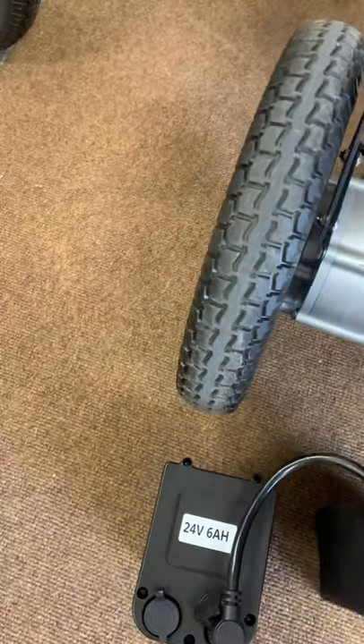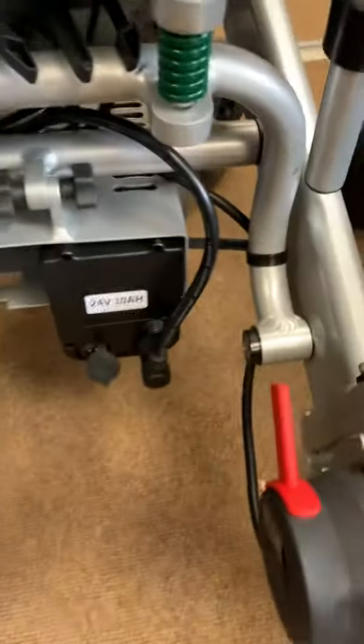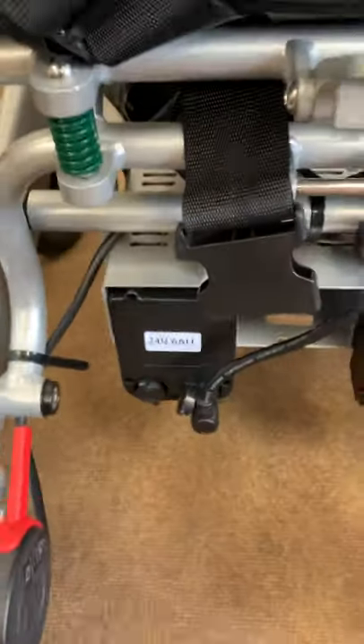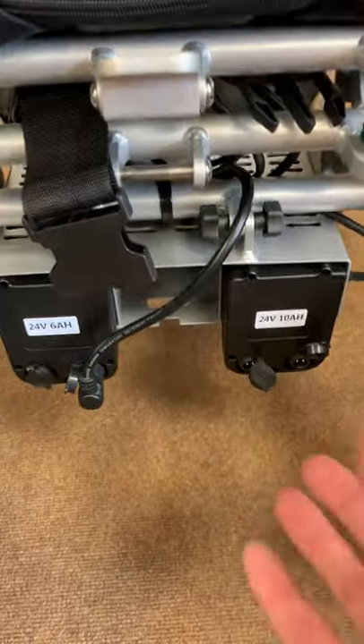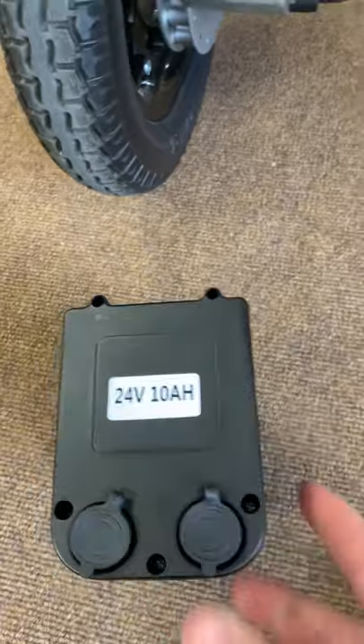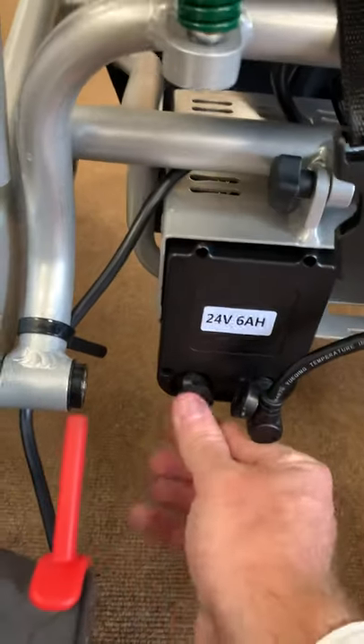The best way to use these batteries on the X is: you've got the 10AH on one side and the 6AH on the other. Run the 10AH all the way down to the last red indicator on the battery bar on the joystick. At that point, turn the joystick off, undo the switch, and switch to the 6AH. While the 6AH is running, take the 10AH off the chair and charge directly into the battery itself. Remember — whenever these ports are open on the chair you risk letting water into the battery, so always make sure your battery ports are covered.